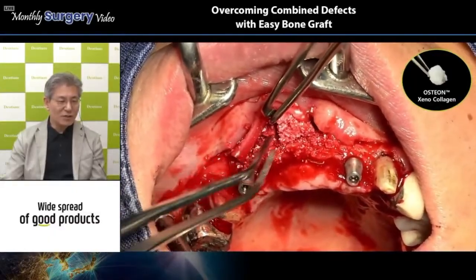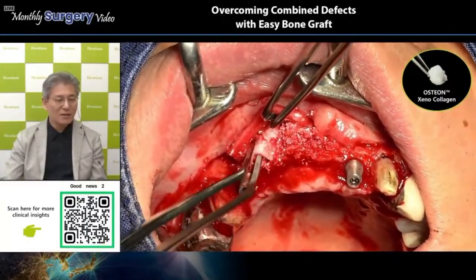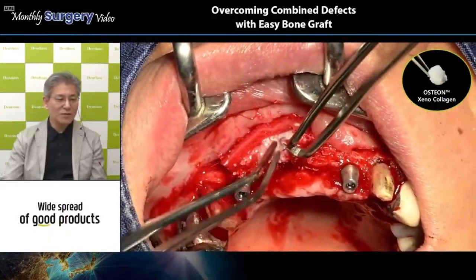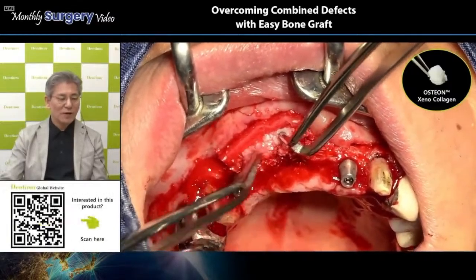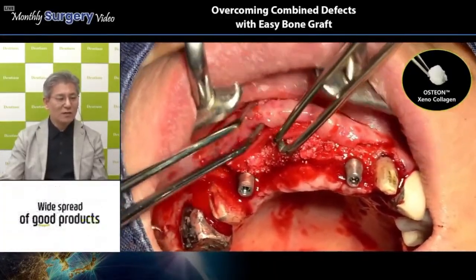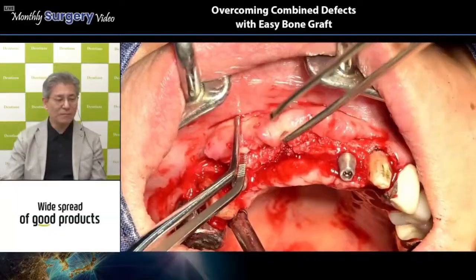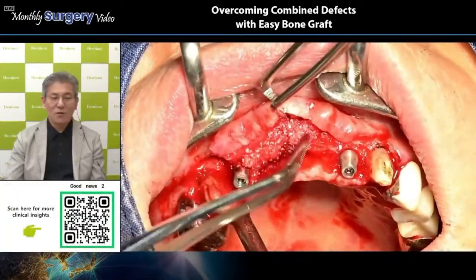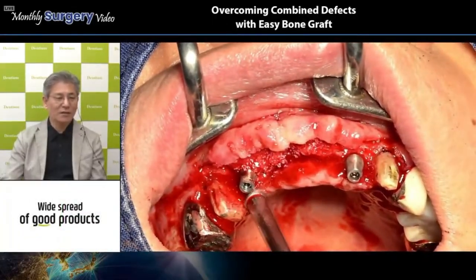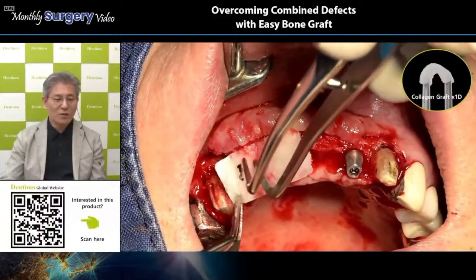Now the interesting situation: in the previous procedures, normally, a collagen membrane was applied for the GBR procedure to maintain space and to give us stability and security. However, this time, Dr. Chung is going to use a collagen graft instead of a collagen membrane. Why? This collagen graft is much better for soft tissue healing, right? So if you want faster soft tissue healing, you may use this collagen graft. It's better.